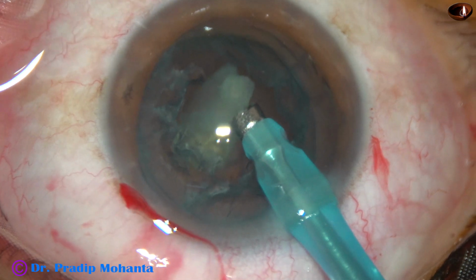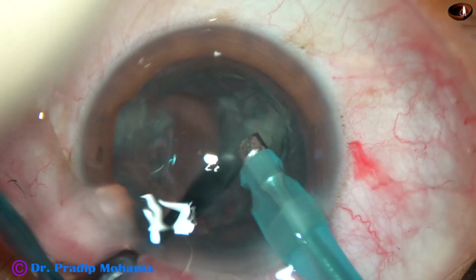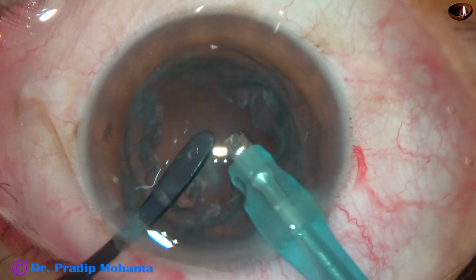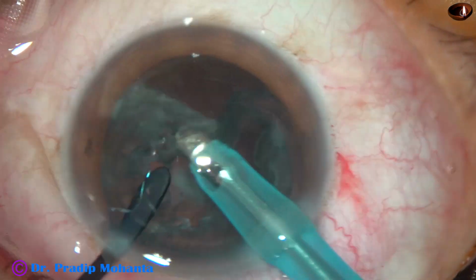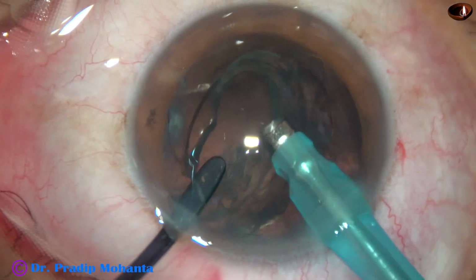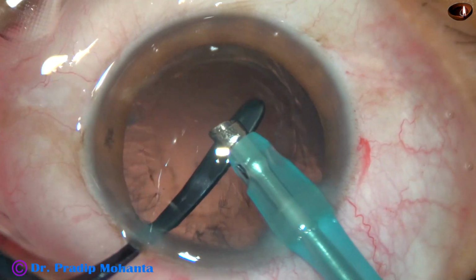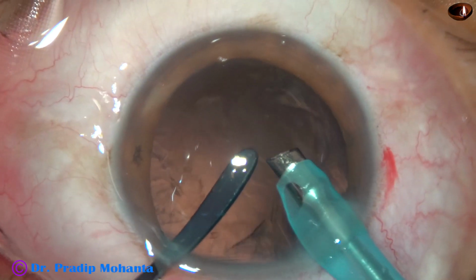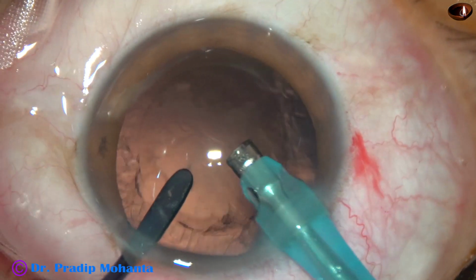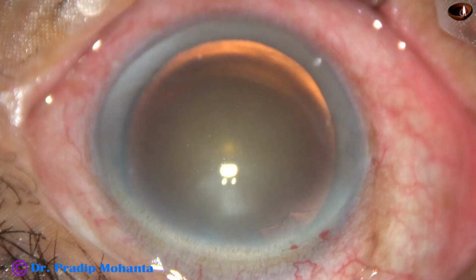Now see the posterior capsular protector, which I use for the last piece occasionally. Not always, but this is very safe. It is placed just over the posterior capsule and the handpiece removes everything: the last piece, epinucleus, even some cortical matter when the posterior capsular protector is there.